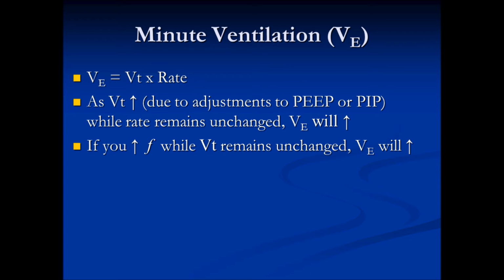That goes back to the conversation we had regarding going up or down on your inspiratory pressures or going up or down on your expiratory pressures, because the difference between the two is what you're ventilating with.